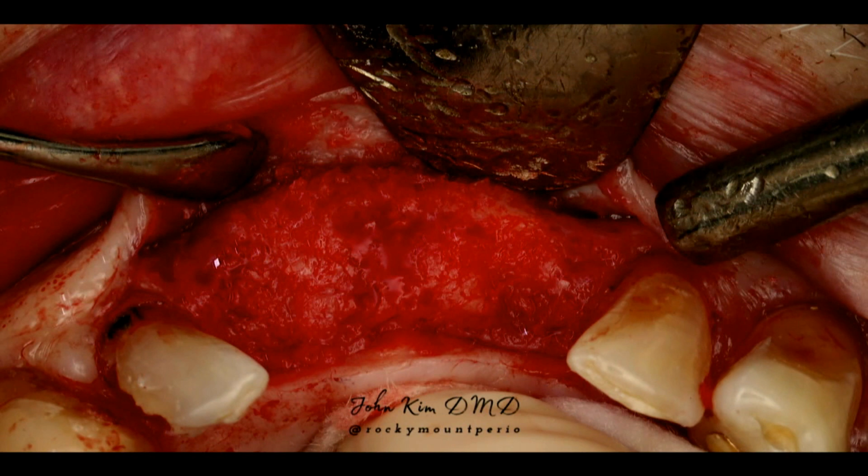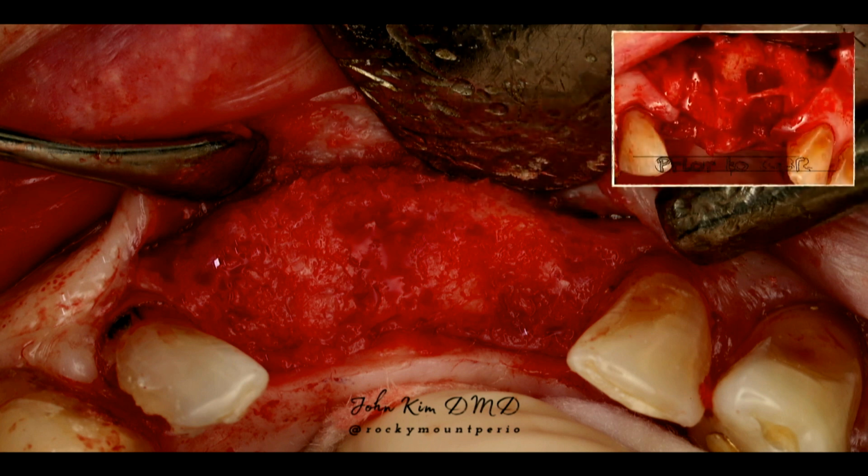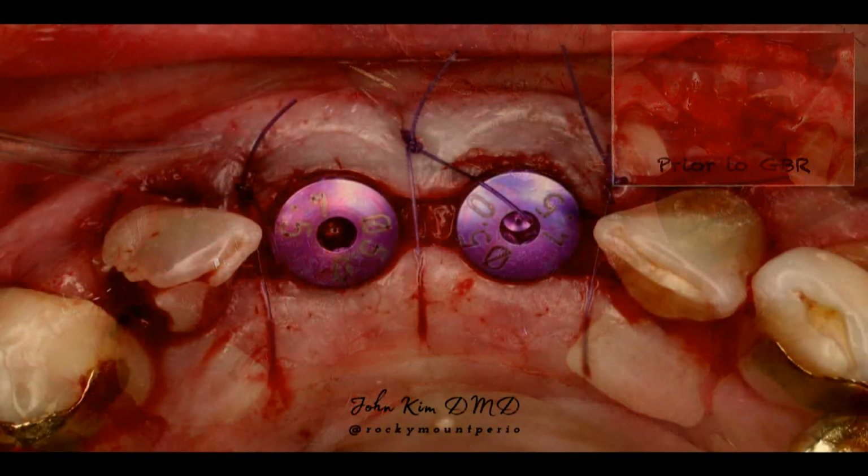And here we are at reentry. It's easy to get excited about what may look good on radiograph, but I'm always holding my breath until I see what I have clinically. At reentry, I don't see many residual bone graft particles. We had good turnover, and this made for a very simple implant surgery in a case that I was very stressed at the time of the surgery.